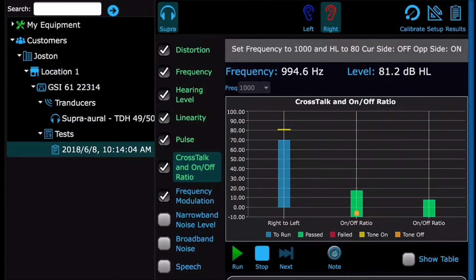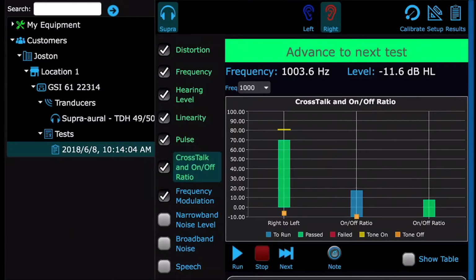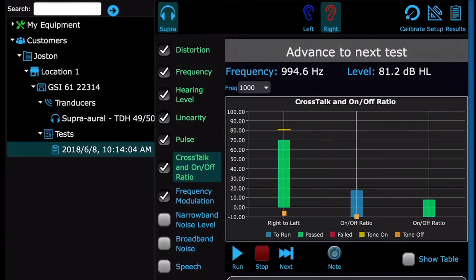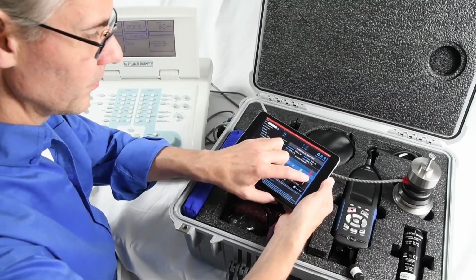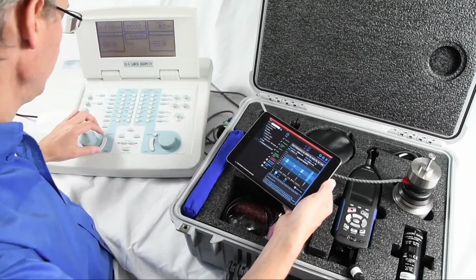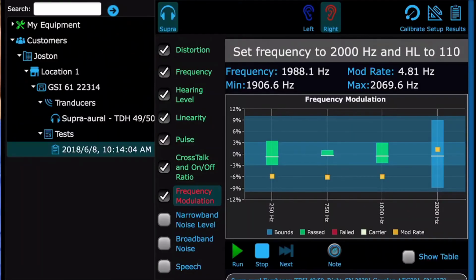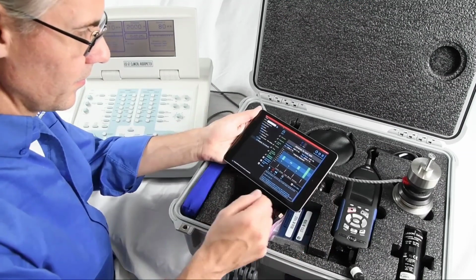Press Run, follow the prompt, press OK, and you can choose to stop the test here or run the other two steps again. You don't need to retake a whole test if only one step fails. In a stop state, do a long tap on that step to redo it. If it's not the last step that you were redoing, press stop when you're done.